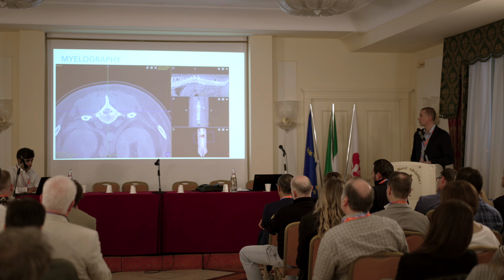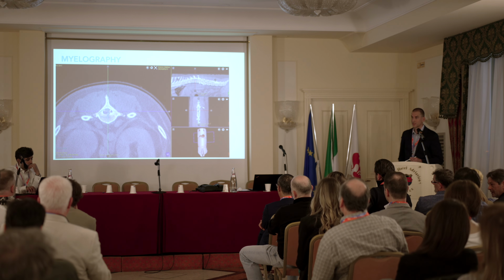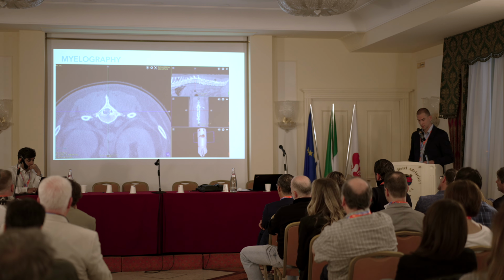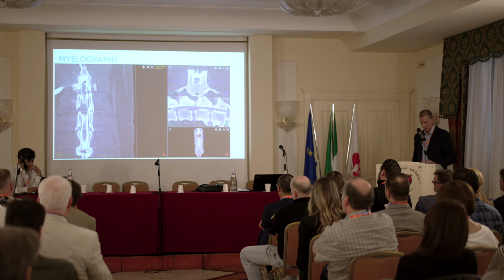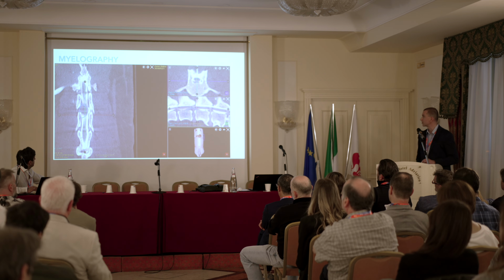So the standard myelo, you can see this part, which is filled with some kind of extruded material. Also, it was a surgical case. Other axis, so still the same dog with a huge extrusion here, and you can see how big the ventral compression is here.